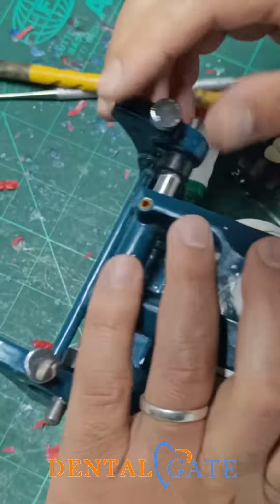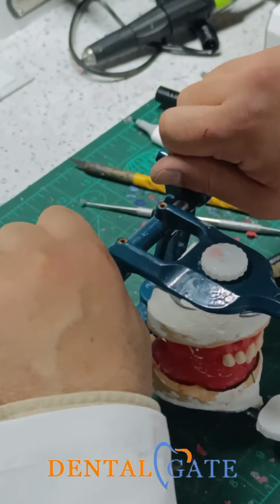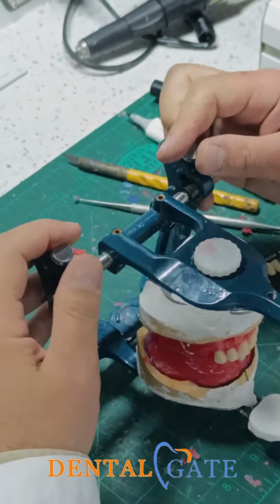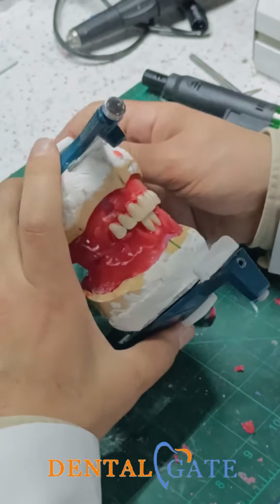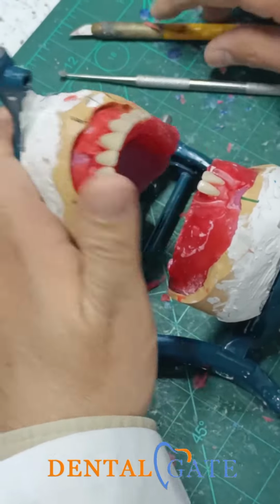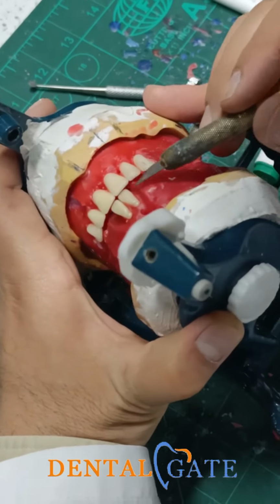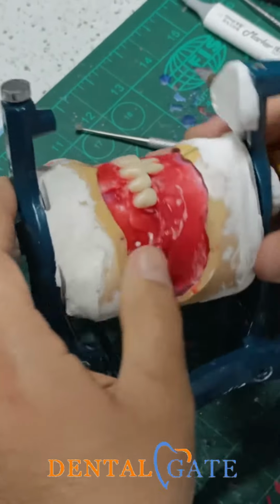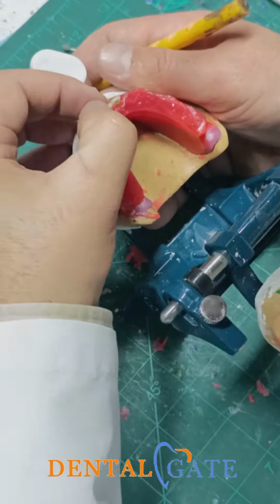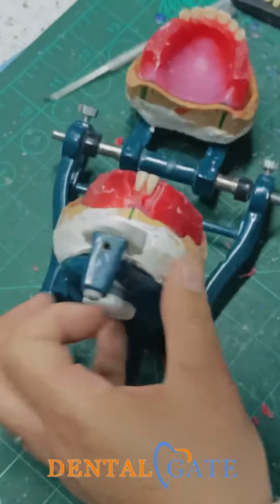Okay. Sometimes this screw should be secured. Please make sure it is precisely secured. Don't make any movement now because we already have the midline. Don't need it now. So this is the midline. This is the 1 millimeter overjet, and we have 1 millimeter of overlapping. Make a double check of all aspects from the top. We have a severe rotation here. You can see we had a mistake if you make an evaluation from the top.